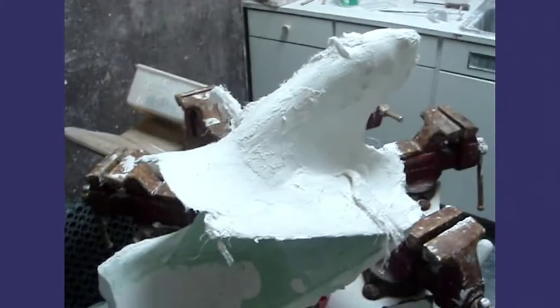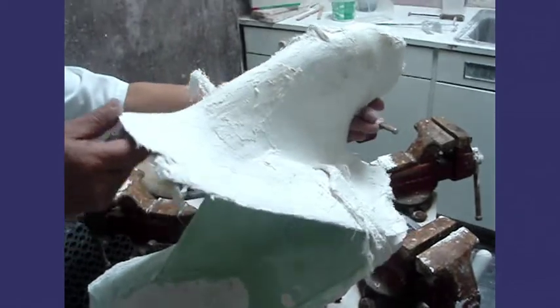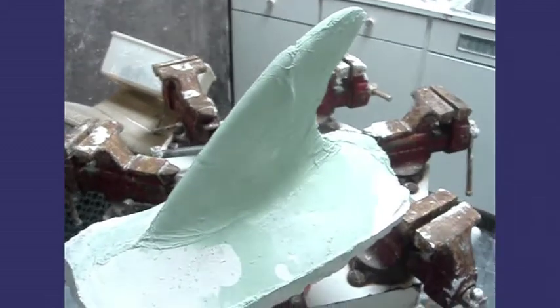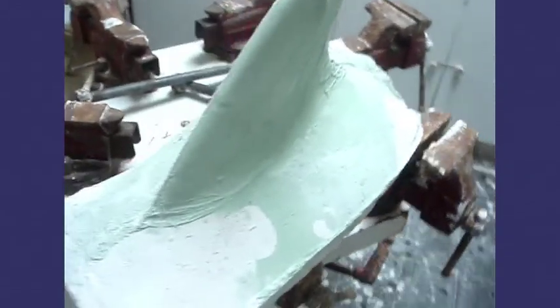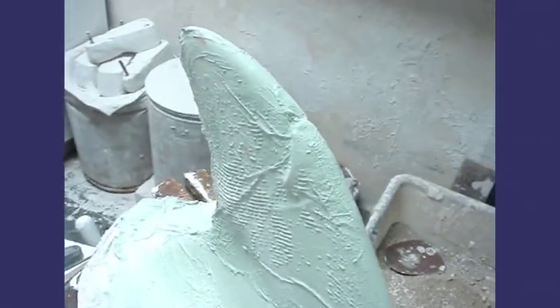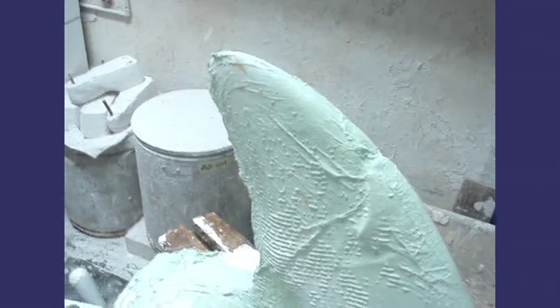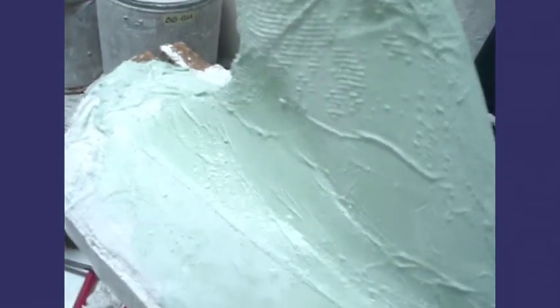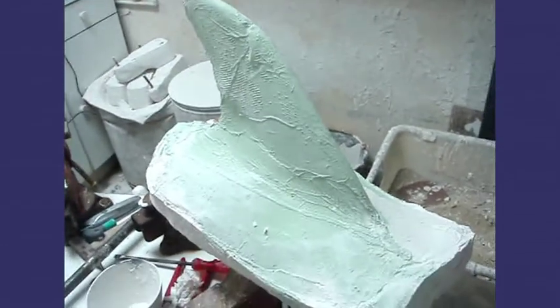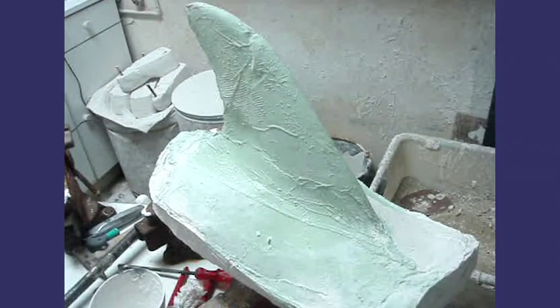And here you can see where we pull the negative off, and there appears the positive. It's a little dark, you can't see exactly, but you can see here where the cut started going all the way down to the base. But here you can see it better. And this is still the rough mold. So we had to work on this mold to prepare it to make the actual device.